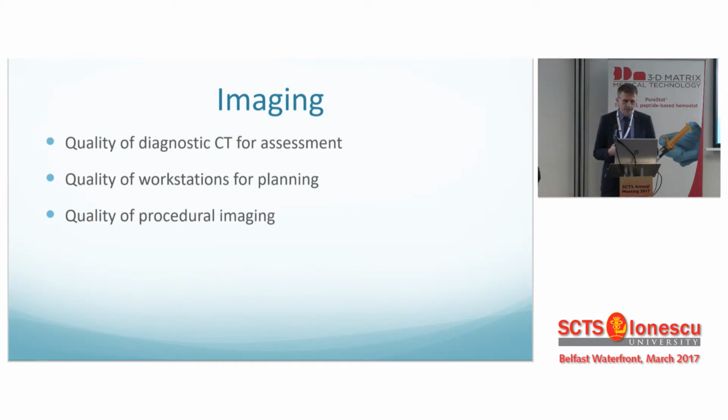Since those times when we did these procedures, there's been a huge evolution in many aspects of the procedure, particularly the imaging. The quality of the diagnostic CT that allows us to assess cases is hugely better, as with all computing. The quality of the workstation, similarly, we're not having to do these laborious handwritten plans. The quality of the procedural imaging is huge. When that branch case I showed you, we used to have image intensifiers lined up down the corridor, wheeling them in to overheat and roll them out again and bring in the next one. And you know, it wasn't a lot of fun.